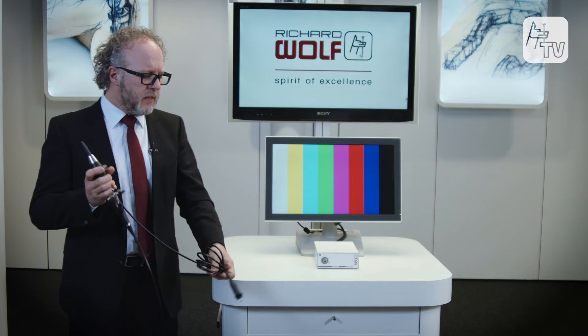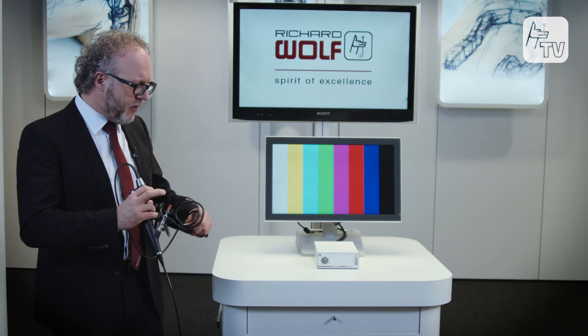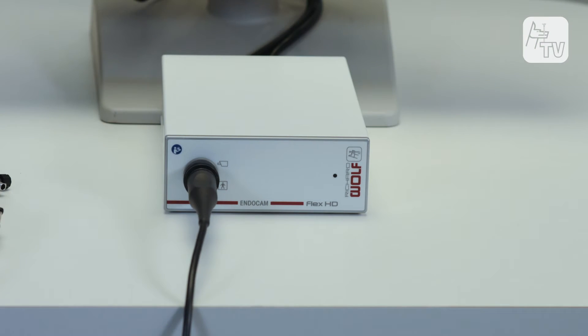This cystoscope can be connected directly to the EndoCam Flex controller without having to use an additional light source or a fiber light cable.